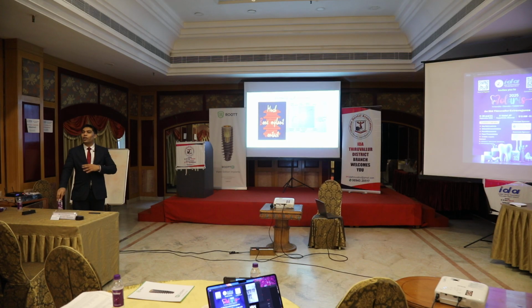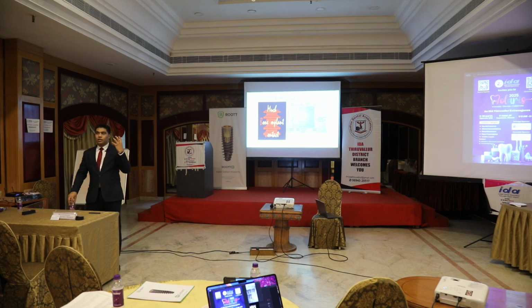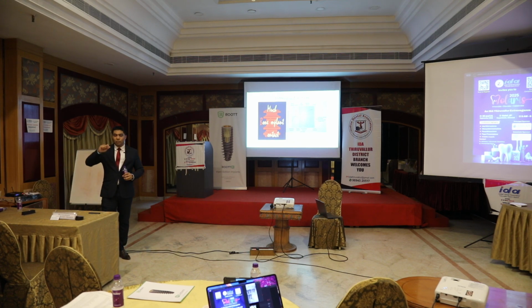They will say, okay, no problem, we have invented this Lindemann drill with side cutting, you can always change your orientation. But once the path is established, an implant is a mechanical entity. Any mechanical entity, when you place it, will always follow the path of least resistance. So no matter how well you do the adjustment of the osteotomy, when you place an implant, it will already be shifting to the buccal side. Why?